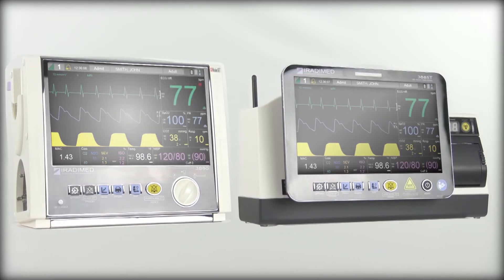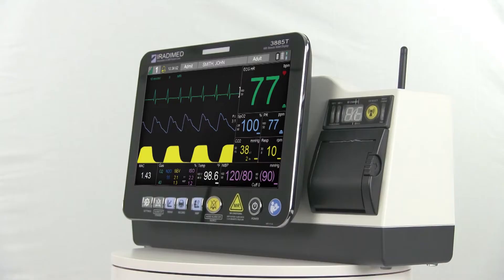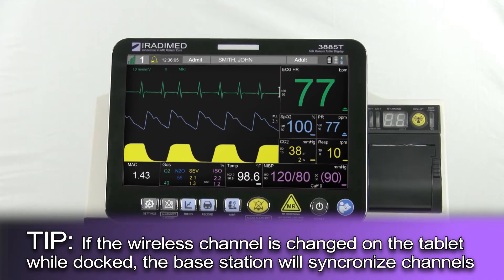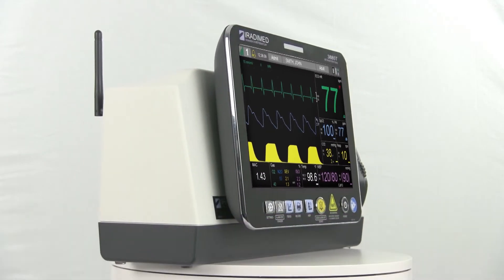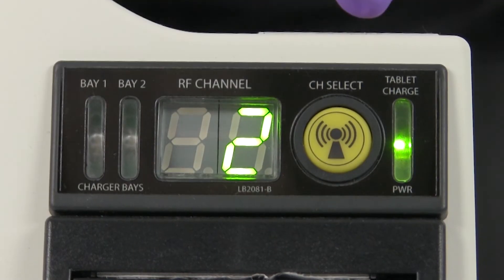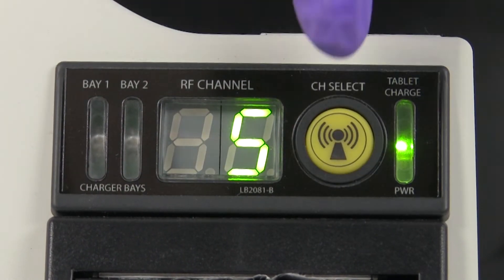To connect the control room components to the 3880 system, ensure the wireless remote tablet is properly docked to the base station and both are turned on. If the remote tablet is not docked to a base station, or your system is on an older software revision, it might also be necessary to adjust the wireless channel on the base station independently. To do this, press the yellow button and select the channel that matches the 3880 system. The channels cycle from one to eight — press the button continuously until the desired channel is selected.